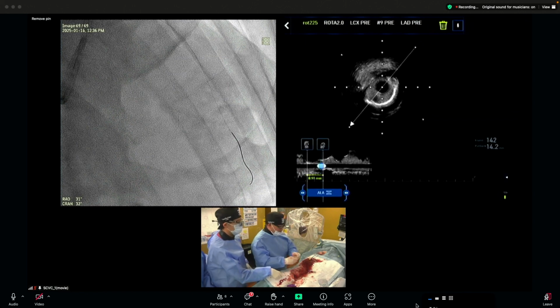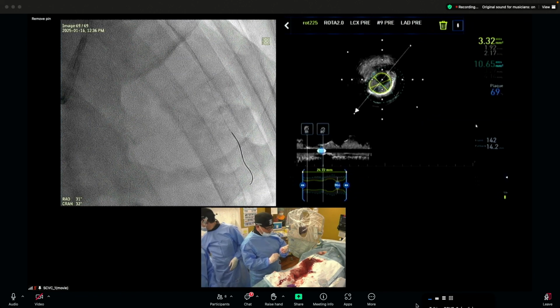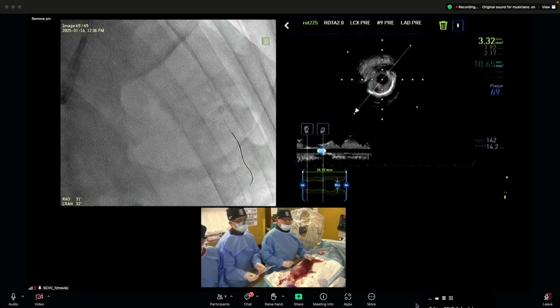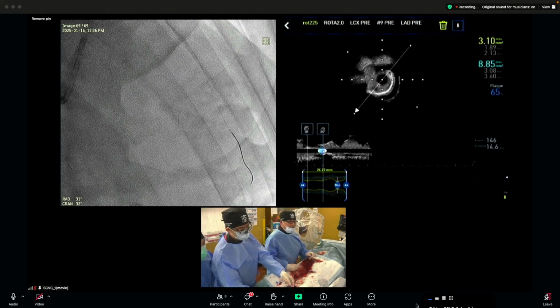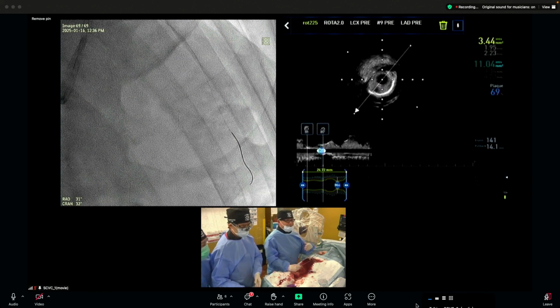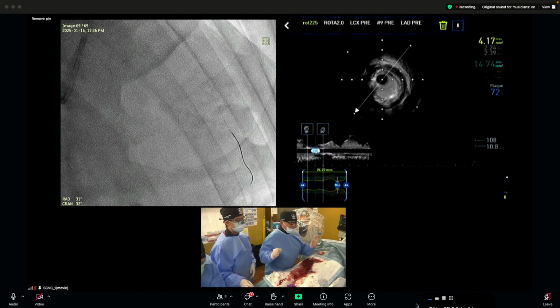What do you think about low speed polishing after high speed polishing? Yes, good comment. Thank you so much. Slow speed rotablation is original to our technique. More than 10 years ago, we recommended low speed rotablation at about 100,000 and 120,000. However, we found some injury like OAS, so we stopped that procedure.